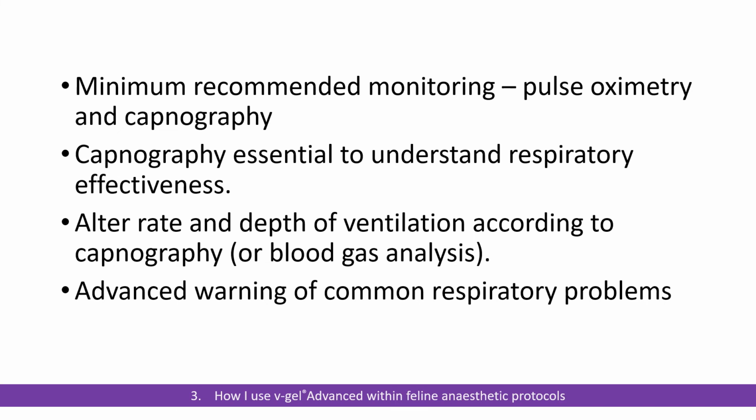So anaesthetised patients don't have an effective respiratory system. The respiratory system is being suppressed, and CO2 can build up gradually over time, and that builds up to higher and higher anaesthetic risks. If you know that the CO2 levels are building before those CO2 levels get toxic and start causing problems, it's a very easy thing to do to ventilate your patient and bring those CO2 levels back down again. And of course, if you're not lucky enough to have a ventilator in your clinic, you can squeeze the rebreathing bag and manually ventilate the patient to bring those CO2 levels back down again.